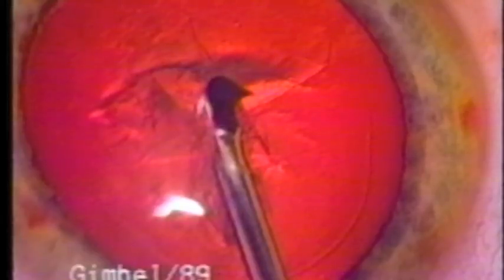This case has positive vitreous pressure and will illustrate the risks of doing the continuous curvilinear capsulorhexis without a viscoelastic. If the tear which stopped here was continued, I could sense that it just may veer off toward the equator.